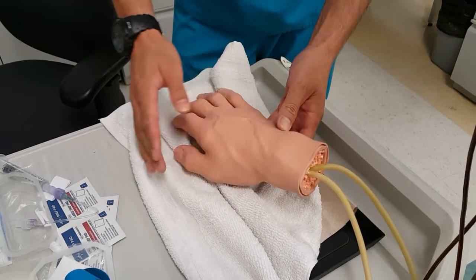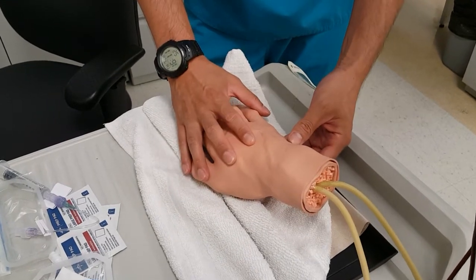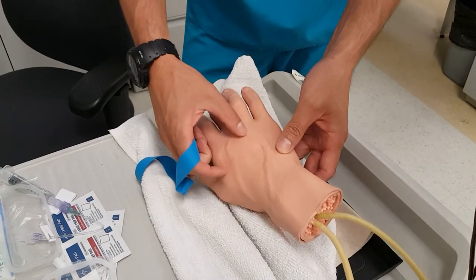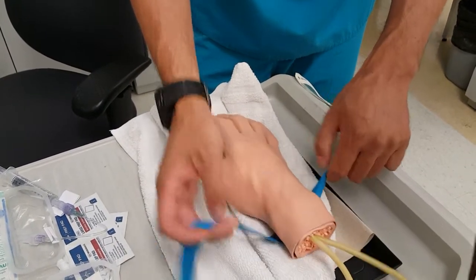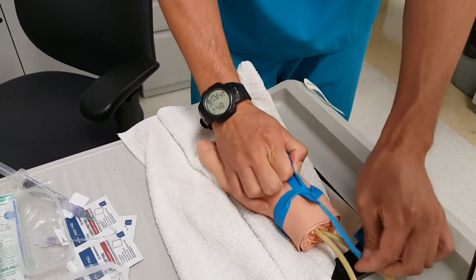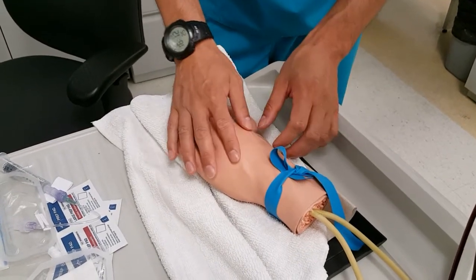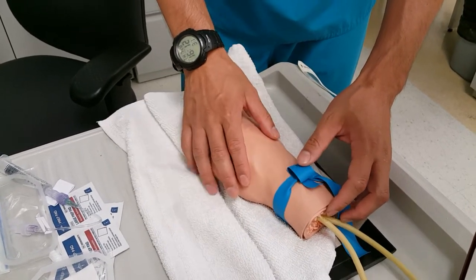You're going to do your assessment — quickly look and see the veins. For some patients, due to their age or dehydration, you're not going to see the veins right away; that's when you add on your tourniquet. For this example the vein is very prominent on the hand model, but if it wasn't I'd tie my tourniquet. Really when you get proficient at IVs, it's much more of a feel than a visual, because sometimes you are going to go in blind.